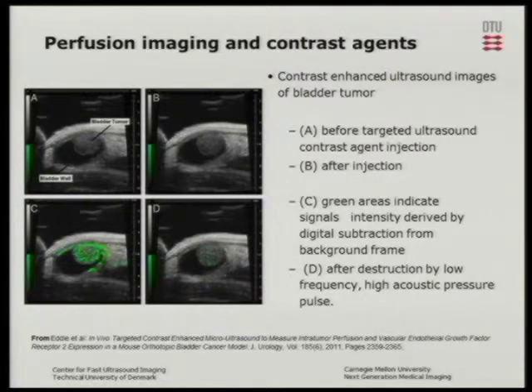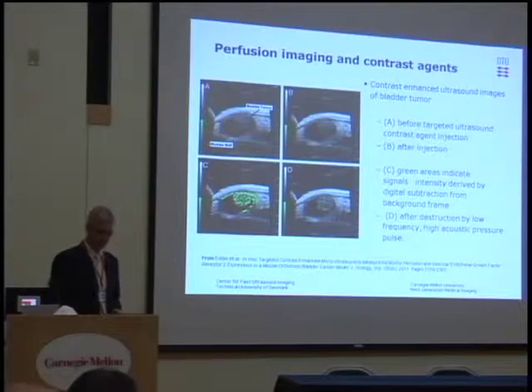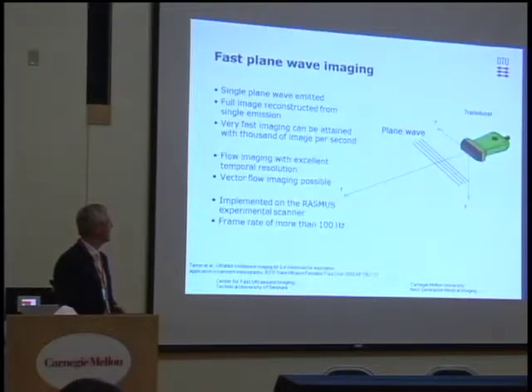What is done here is that the vasculature of the tumor, of course, is really important, but you have to use a contrast agent these days to find this. But I think that if we have continuous imaging, and if we can average over a long period of time for the slow velocity, we would also be able to see some of that. Bigutander is here, he's going to show some of it also later on.